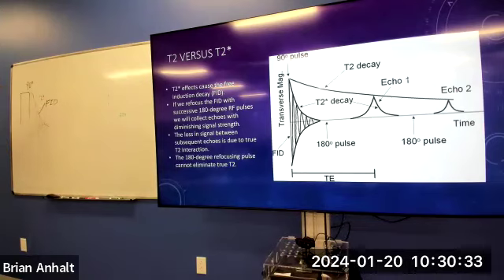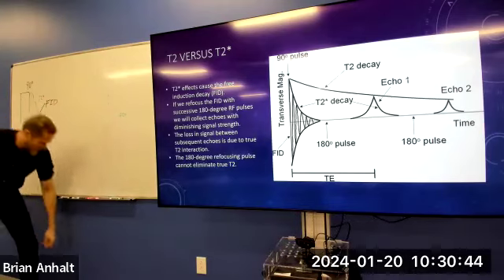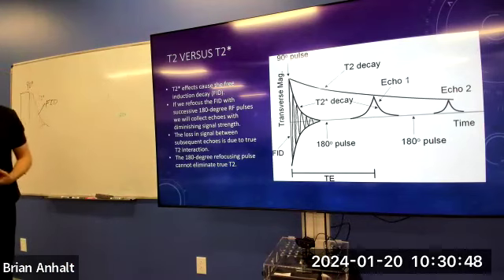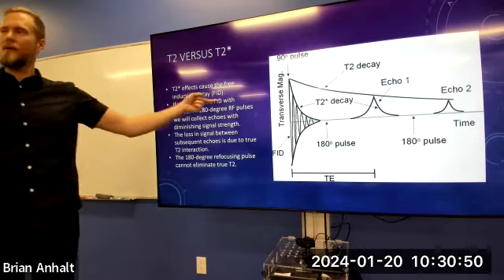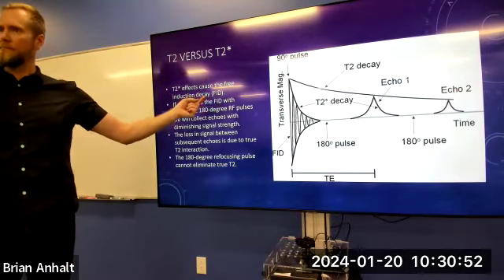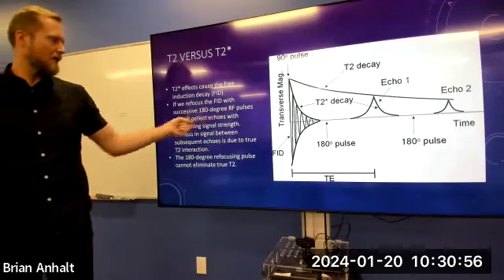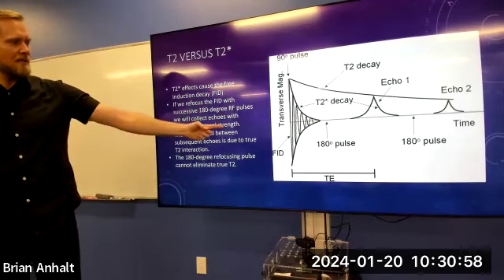I know it's a weird three words together. Just saying induction, right? Induction in the coil by the transverse magnetization is freely decaying. It goes away. We're not doing anything to keep it in phase. If we refocus the FID, like we saw in that video, with a 180-degree RF pulse, we will collect echoes that also have diminishing signal strength.